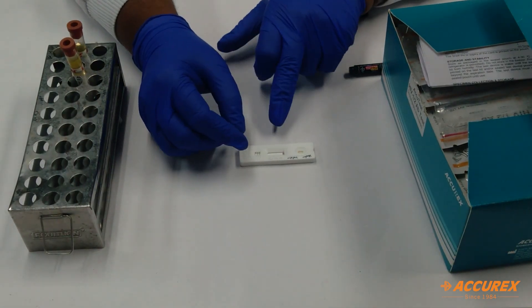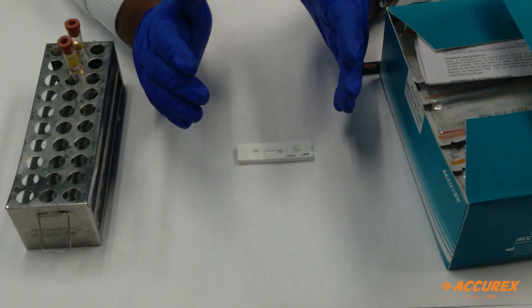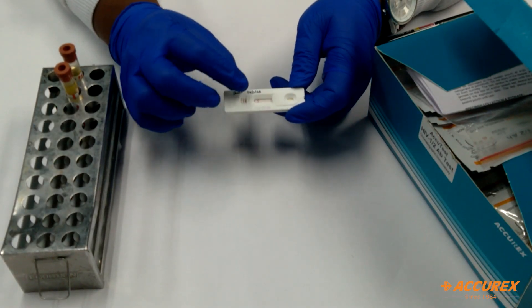Now the process has started. It will take 10 to 20 minutes to get the result. Always make sure to bring the pouch or kit to room temperature before moving to the testing part.